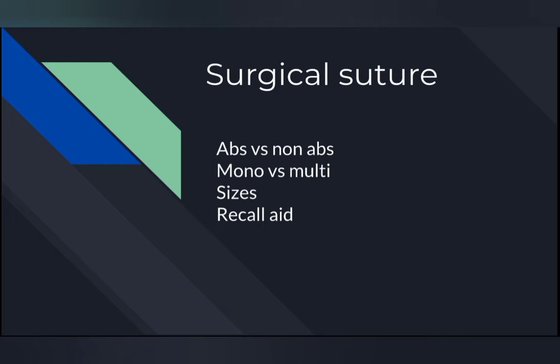Moreover, if you want to get a quick idea of what these numbers mean, you would want to use smaller sizes in more sensitive areas, like for example the face, the neck, the penis. For all of these areas you can use a smaller size, from the US gauge, you can go from 4-0 to 6-0. That is the downwards scale which I had mentioned.